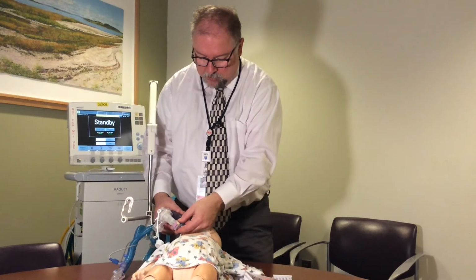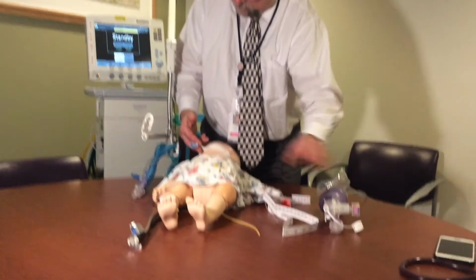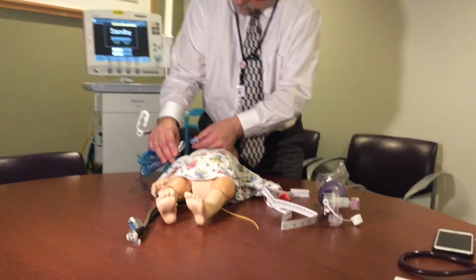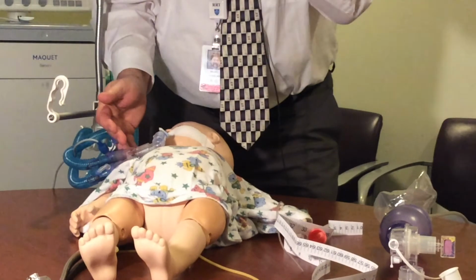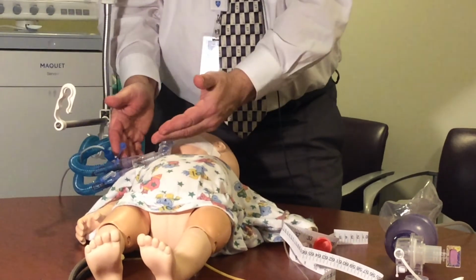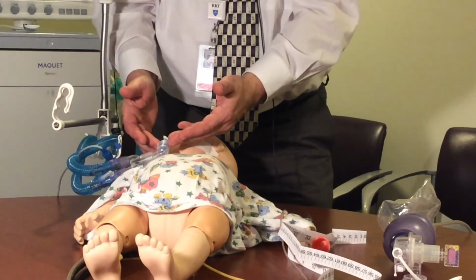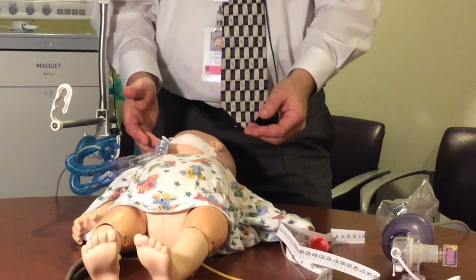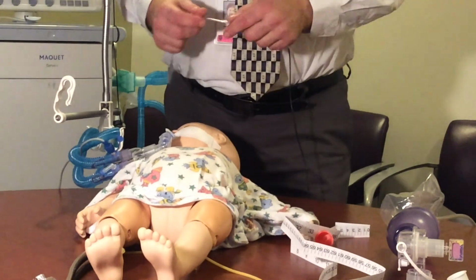The tube's been secured. It's time to connect to the ventilator. And it's important that the endotracheal tube be higher than the tubing so that condensation doesn't inadvertently enter the patient's airway where it can cause bronchoconstriction or increase the likelihood of ventilator-associated pneumonia. Now that that's done, we'll suction the airway.